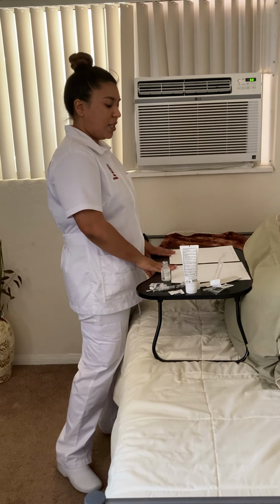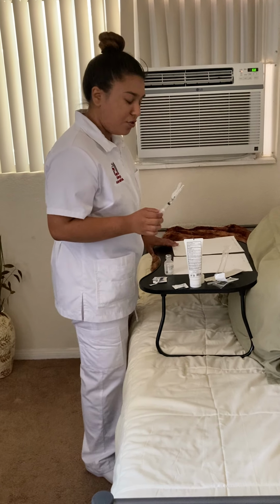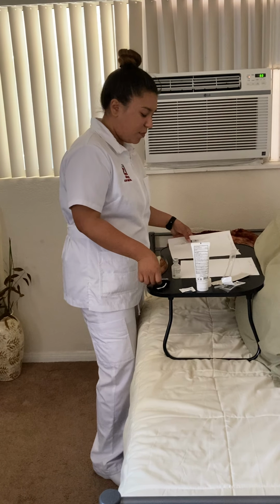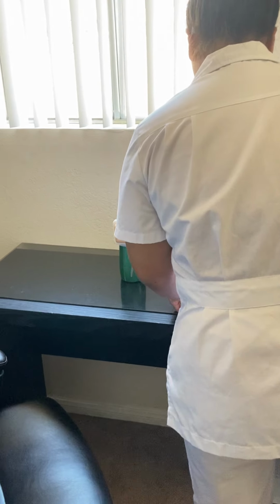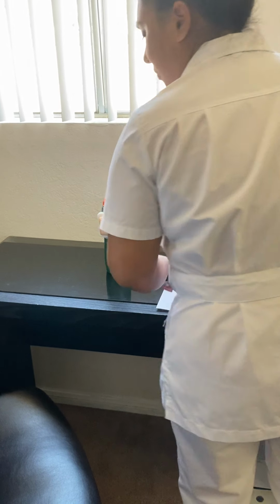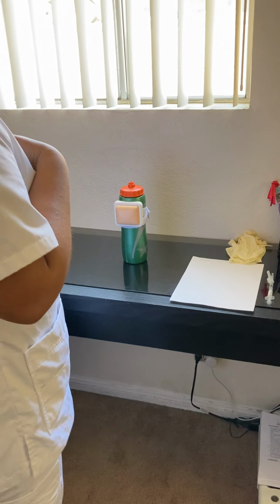So now I'm ready to go ahead and see the patient. So I'm going to take my syringe, the MAR, and some alcohol swabs. Okay. So I'm going to go see the patient now. I'm going to go ahead and perform IPI. So hello, my name is Denise. I'm going to be your student nurse today.